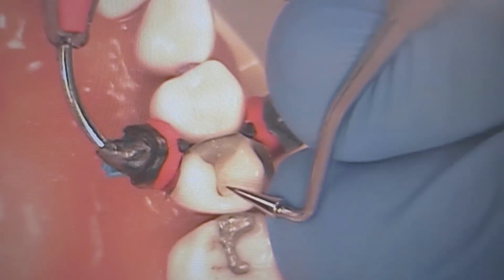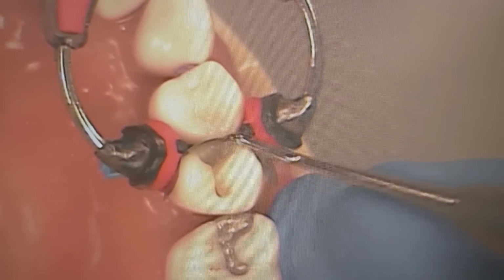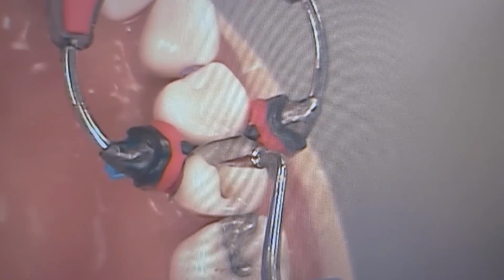Placing the bottom layer. So for this, are you just doing one side? You're doing just the buccal side? Yeah, because this preparation is so tiny. I'm going to try to see if I can pack it all the way to the bottom. Okay. So since the prep is tiny, he's packing it all the way to the bottom.